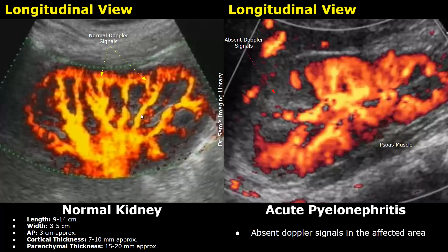In the normal kidney, blood flow is present throughout, indicating normal perfusion. The image on the right is of acute pyelonephritis where the upper pole was affected. On power Doppler, no blood flow is seen in the affected area — the power Doppler signals are absent. This region was hyperechoic, had loss of corticomedullary differentiation, and blood flow was absent.